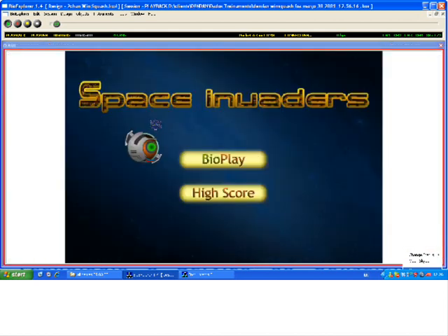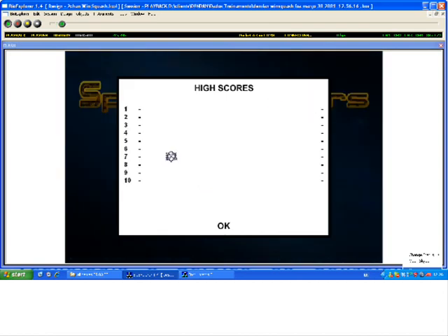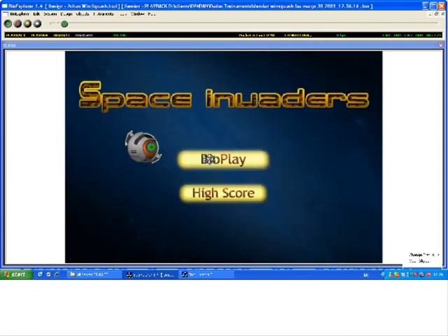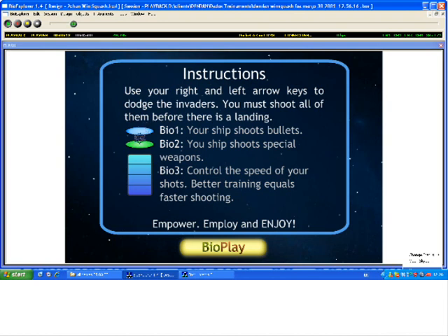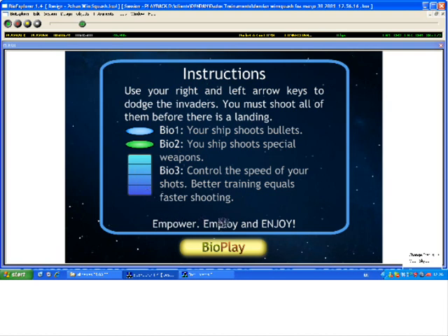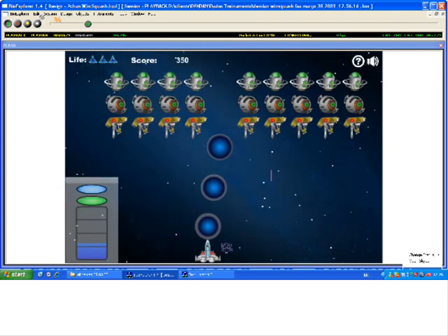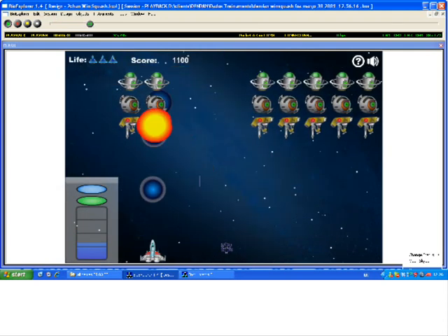The game hasn't started. Let's maximize it. First, I want to show you that the high score allows you to have memory of the best score — you can have championships in your training scenario. Instructions always pop up and are always the same three options: Bio 1, Bio 2, Bio 3. Bio 1 and 2 are on-off, and Bio 3 is variable. So both types of feedback are allowed. I click Bio Play and I'm in the game.